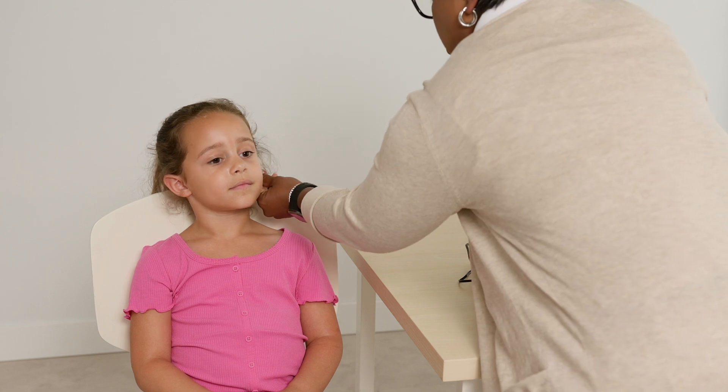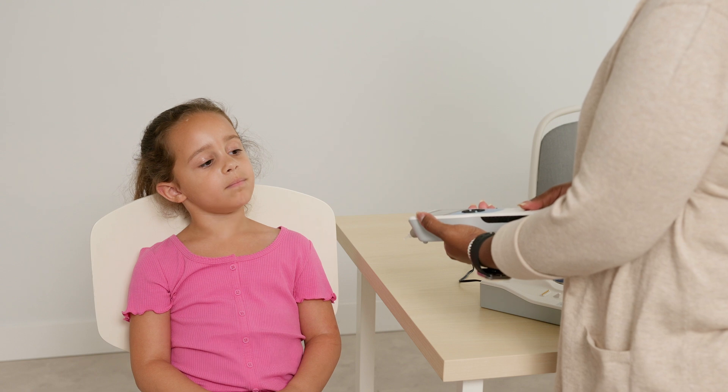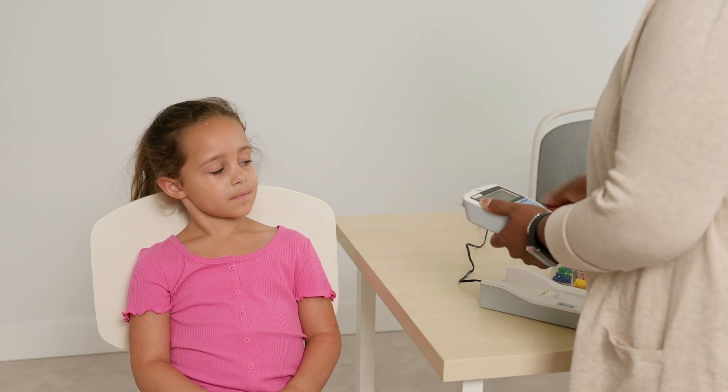Before performing tympanometry, inform the patient what to expect from the evaluation. Explain that you are going to evaluate the way their eardrum moves. They will hear a low tone, feel pressure in their ear canal, and they do not need to respond in any way. The test will only take a few seconds and all they have to do is sit quietly.